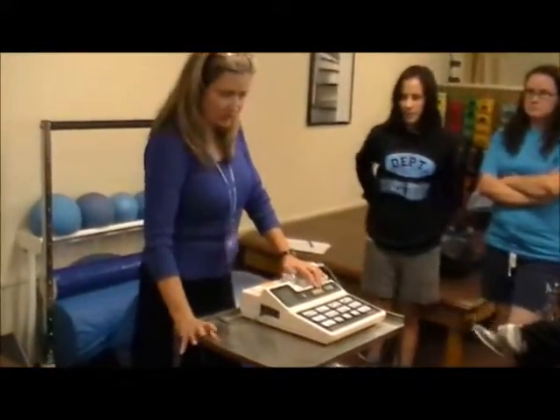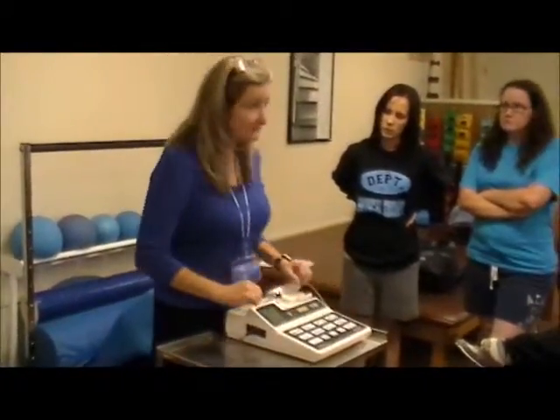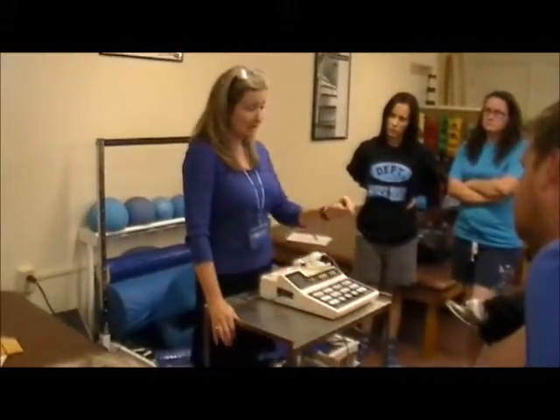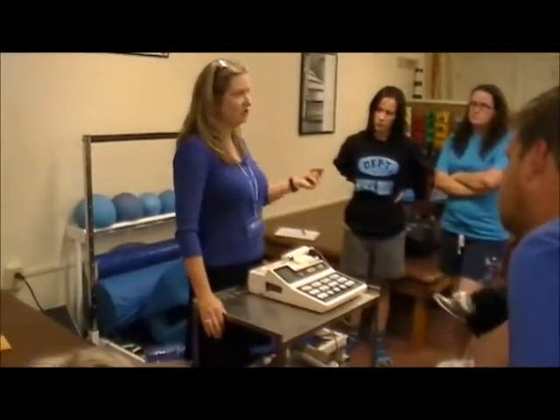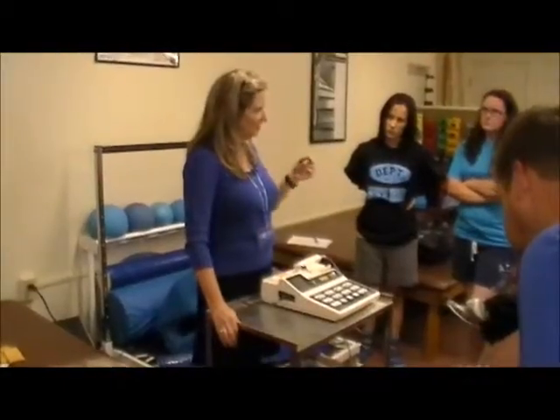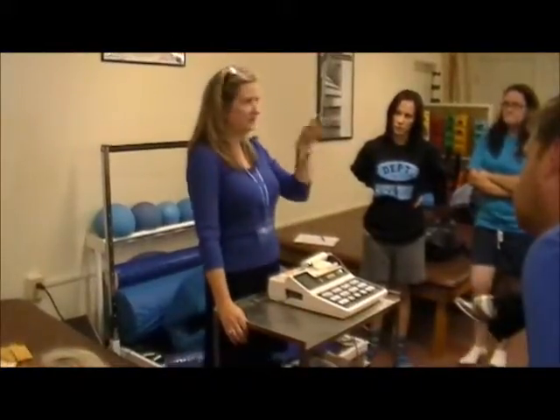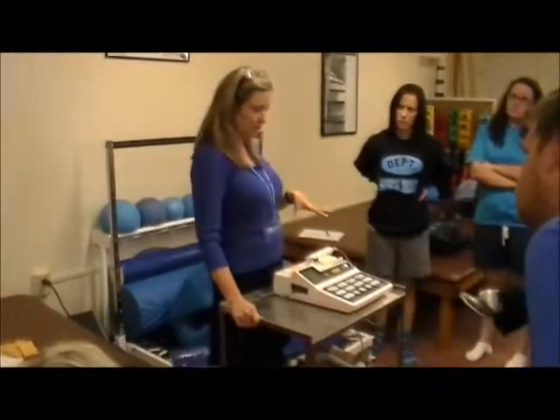What I mainly want you to get out of today's lab is really 3 things: how to work the buttons on each machine, and how to begin to problem solve what choices I would make for whatever I'm treating. So always start with, this is what I'm treating. And again, not a body part. I'm not treating your back. I'm treating a muscle spasm in your back. I'm treating pain. I'm treating edema here. I'm doing this or that. Okay? So you may put the pads in different places on different people in your group.